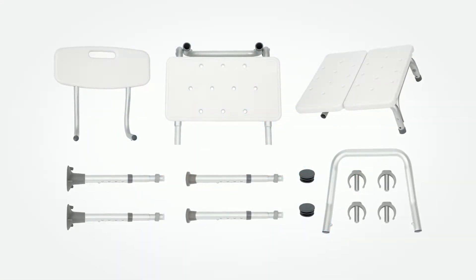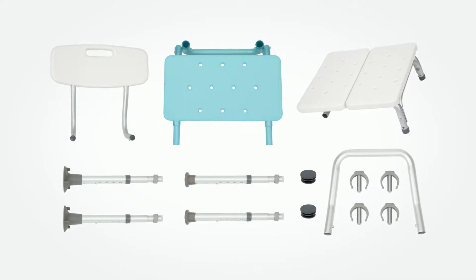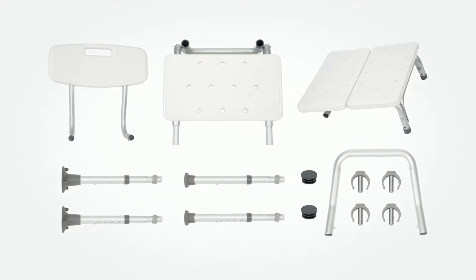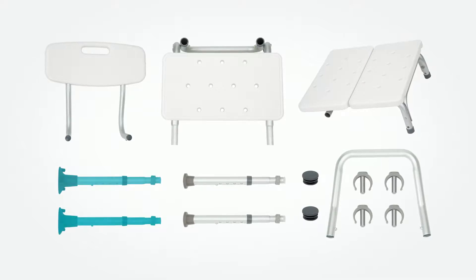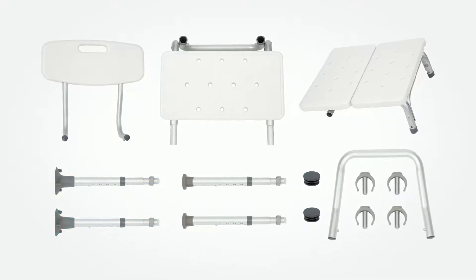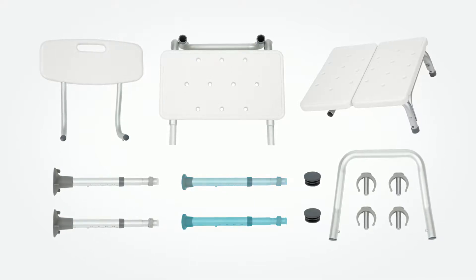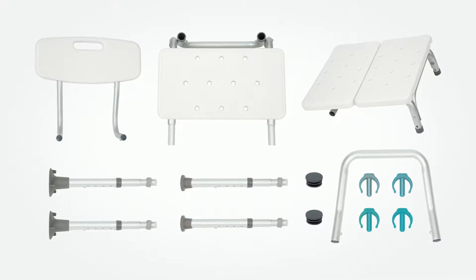With your transfer bench you will find one small seat section, one large seat section, two bench legs with pre-installed suction cup feet, two bench legs with pre-installed capped feet, and four collared locking pins.